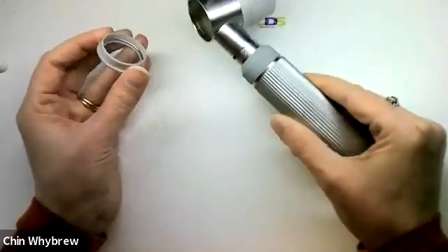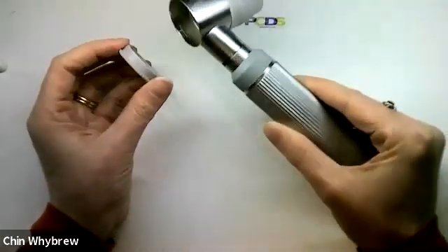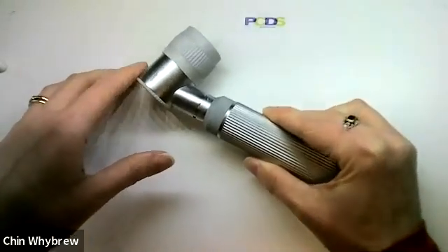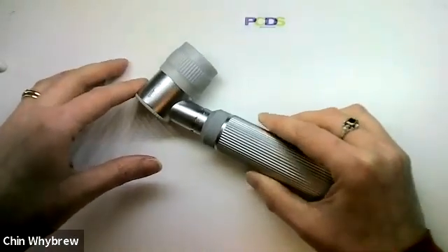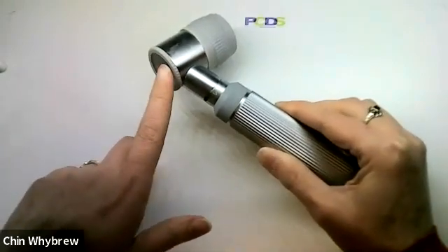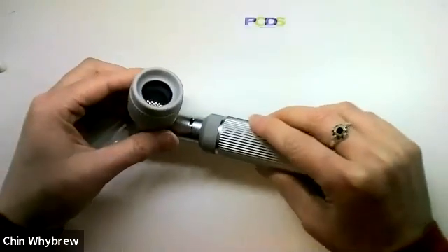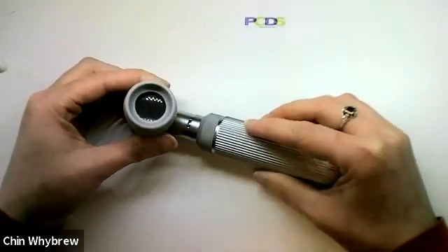Now whilst the end plate does come off, you're not going to be using it without the end plate, because without the end plate it wouldn't be Dermoscopy given that the light is not polarized. So you can use this with contact fluid and put it on like that and you will be able to see something through it.